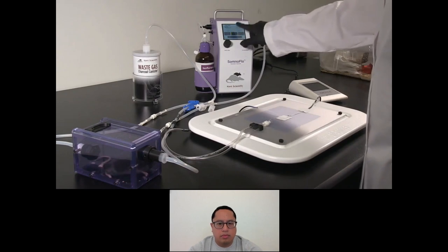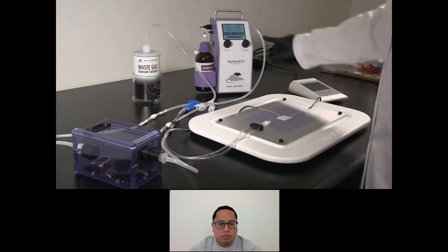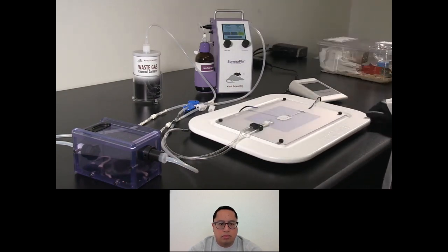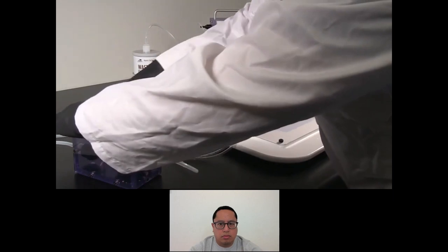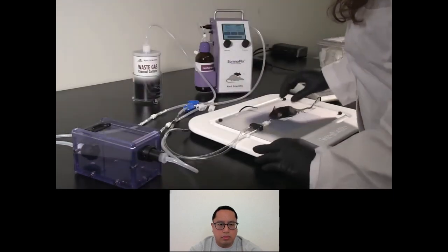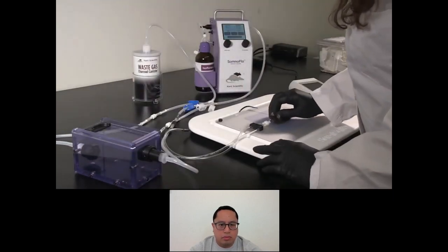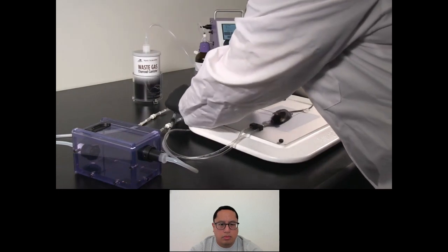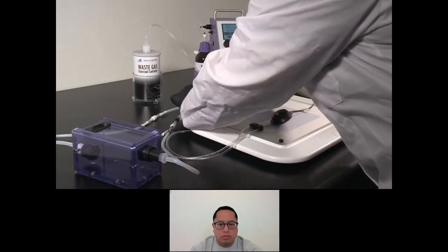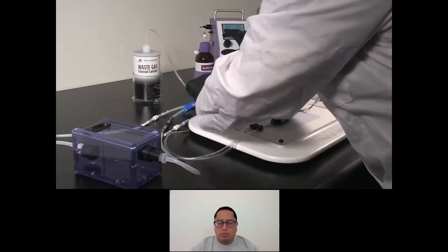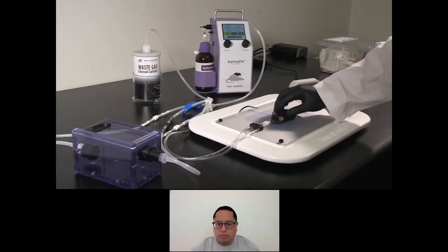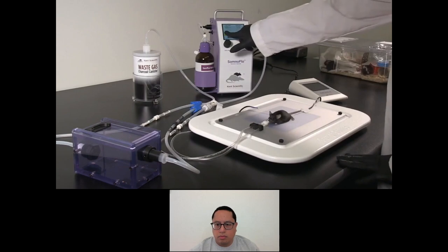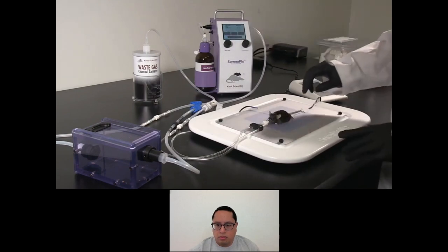When the animal is fully anesthetized, touch High Flow again to stop delivery. If desired, purge the chamber using the Purge feature. Remove the animal from the chamber and position on the nose cone. Be sure to adjust the clips to direct the airflow to the nose cone. Touch Low Flow to resume anesthetic delivery. When you're finished with the procedure, touch Low Flow again to stop delivery and recover the animal.